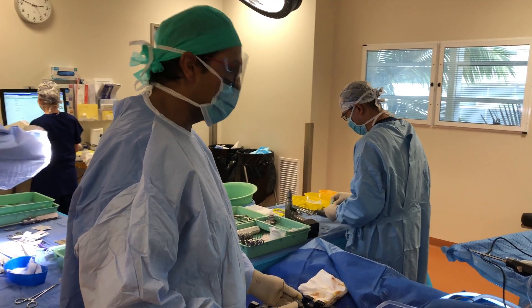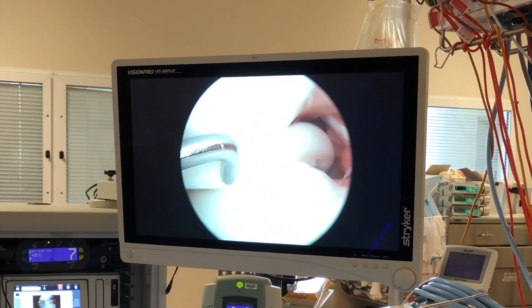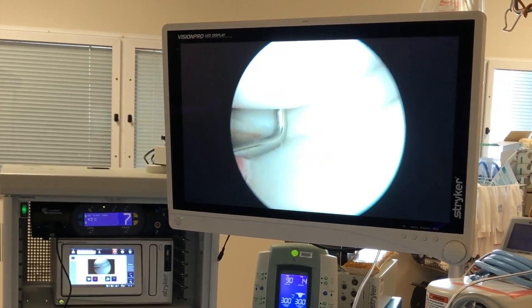Here's a probe that I'm going to insert into the knee. You can look on the screen — the probe has just come through over there. Here's the meniscus that's ruptured and I'm about to reduce it back to where it came from.